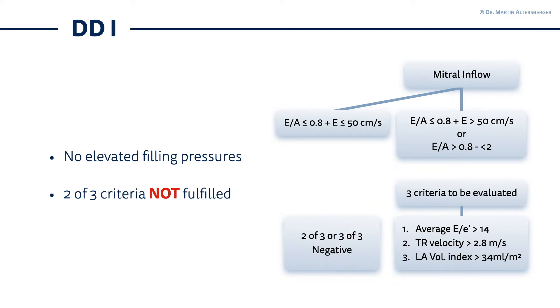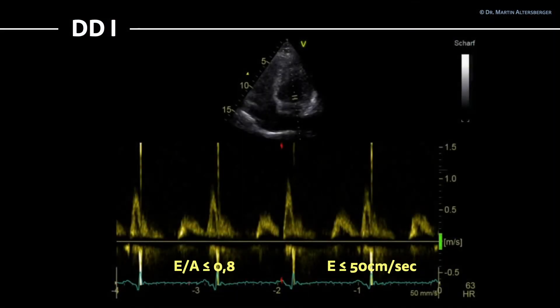Another case of diastolic dysfunction grade 1 in the mitral valve inflow would be an E to A at or below 0.8 plus an E at or below 50 centimeters per second. If you have this scenario it's automatically diastolic dysfunction grade 1 in patients with a sick left ventricle. Let's take a look at an example: we have an E to A ratio of at or below 0.8, and the maximal E velocity — the first of those two curves, the lower curve — is below 50 centimeters per second.